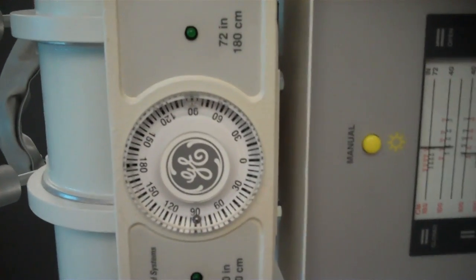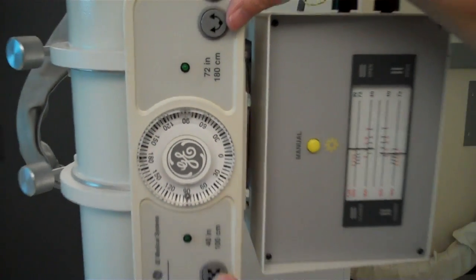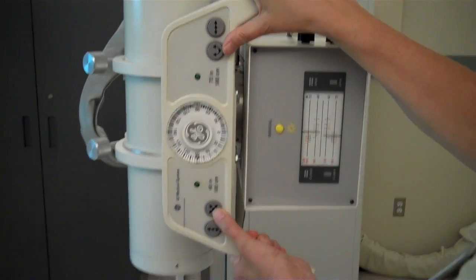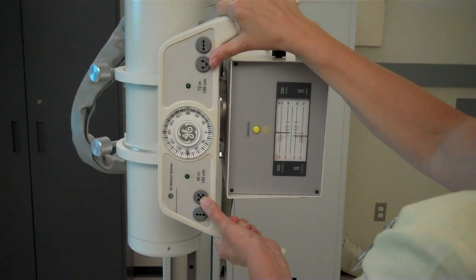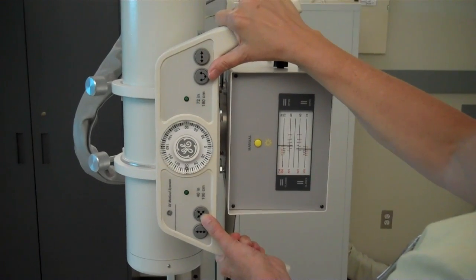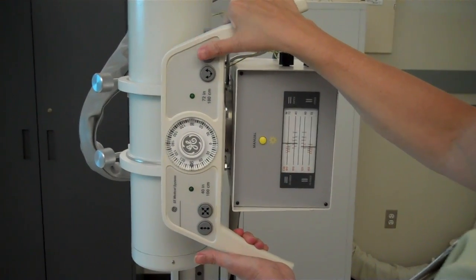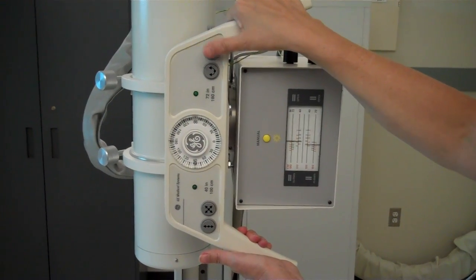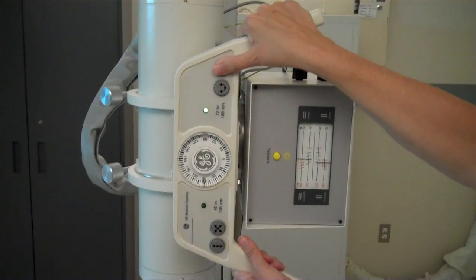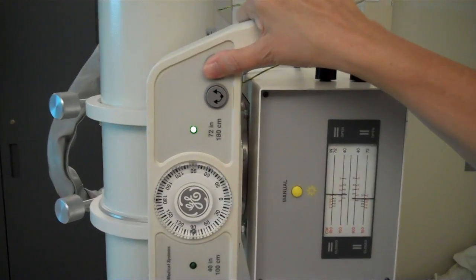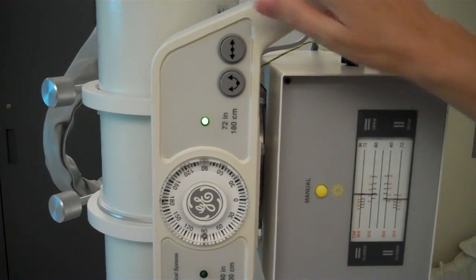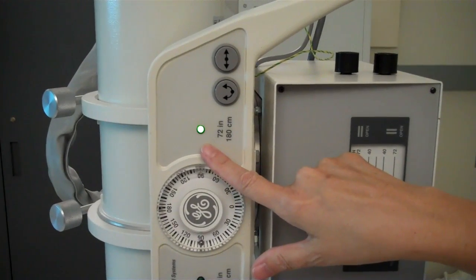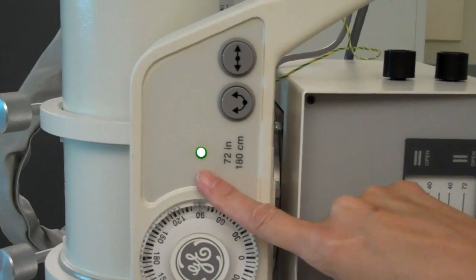We need to align from side to side. So pull and push until it locks into place. And then using the longitudinal button, we're going to adjust the source image receptor center distance, the SID, to 72 inches when the light illuminates.